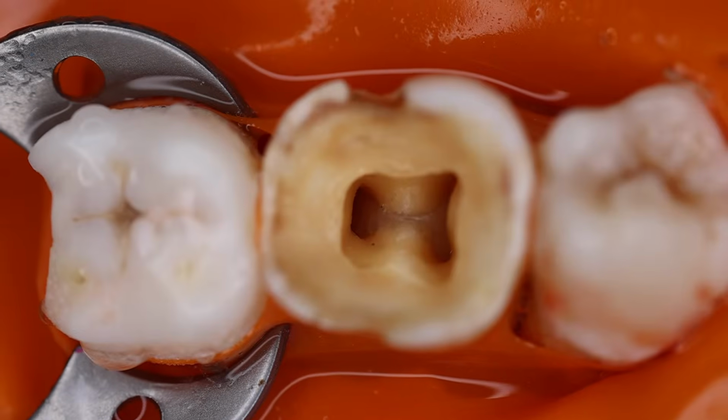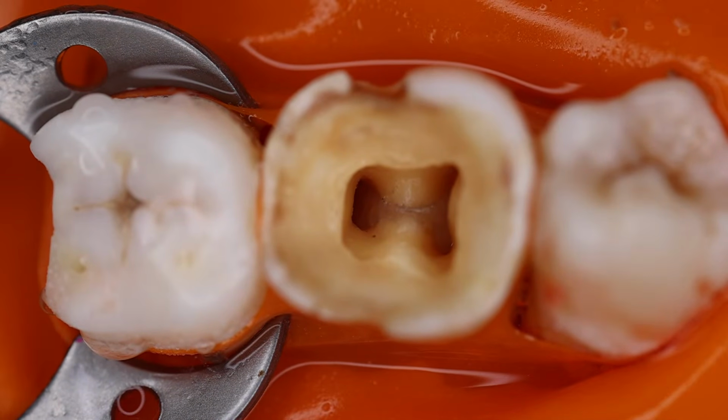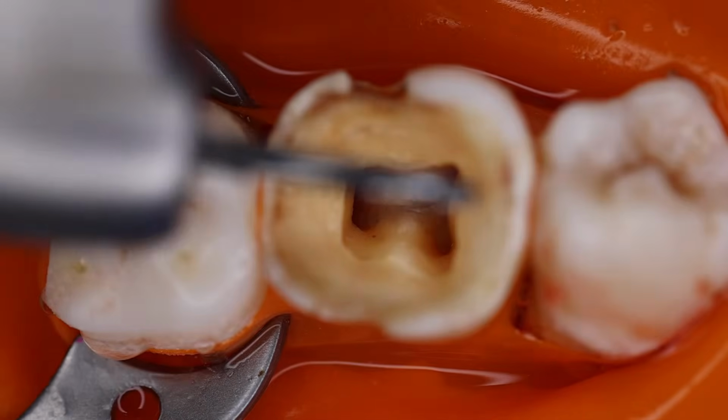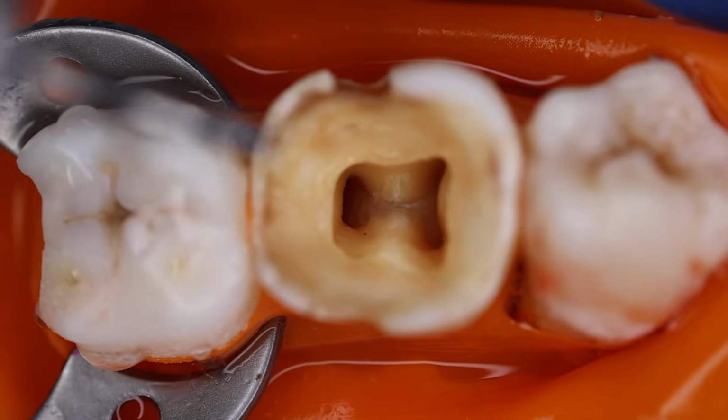For the same, we can begin with the AtoZ bur. Here we have this AtoZ bur and we are just removing the weakened tooth structure that we have.